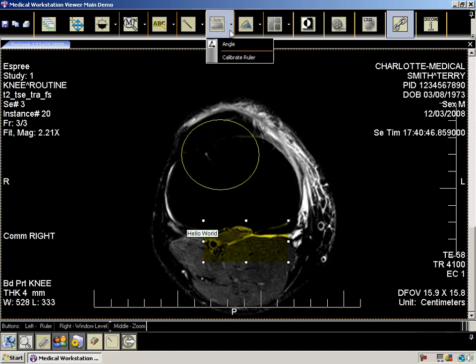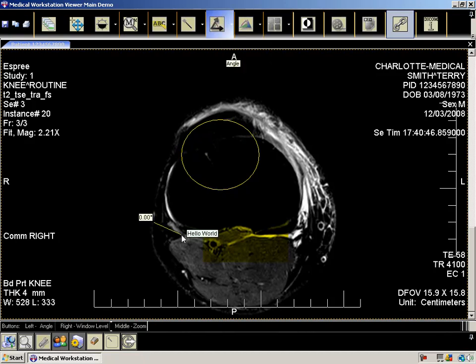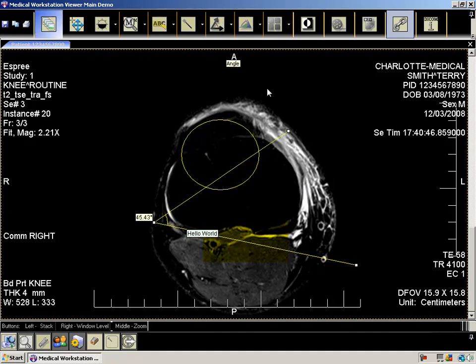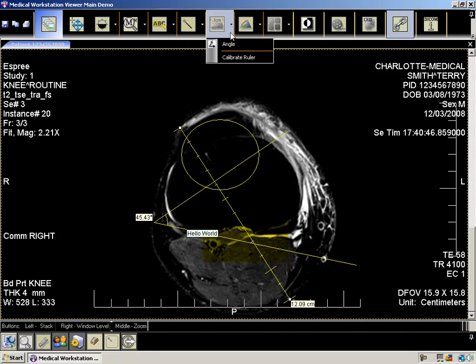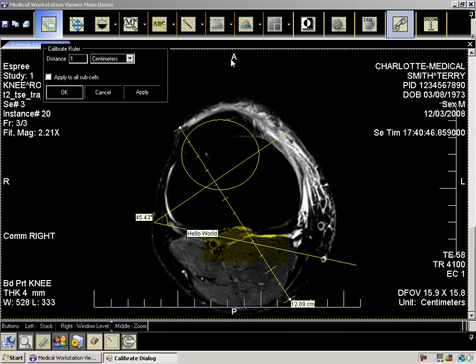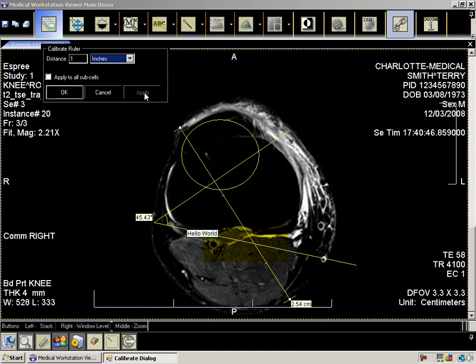We have two measurement tools: the ruler and the angle. The ruler can be calibrated to a known measurement on the image. For instance, if there is an object in the image — such as a ruler — that has a known size, you would overlap the object with the ruler annotation. Then use the calibrate dialog to tell the workstation how long the object is. This calibration can be different for each image.